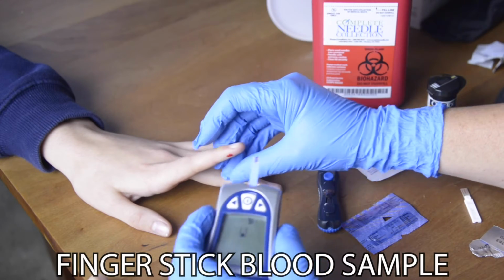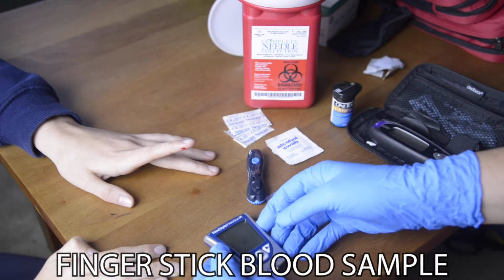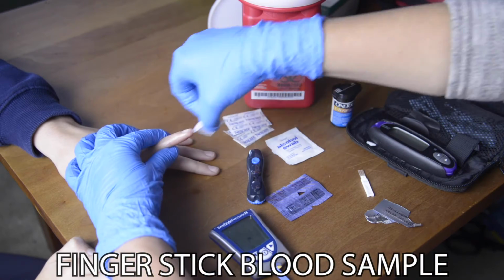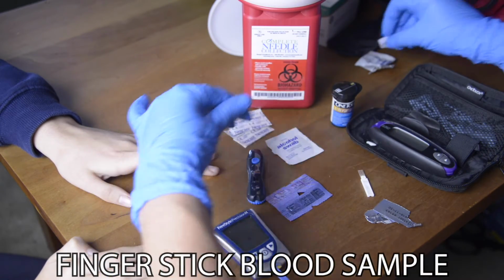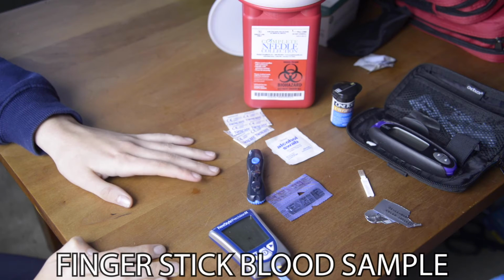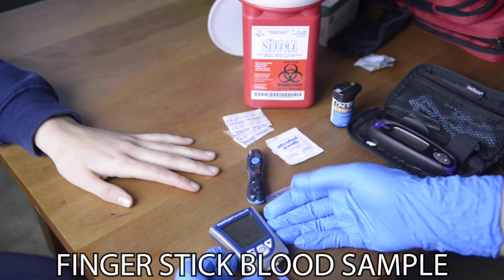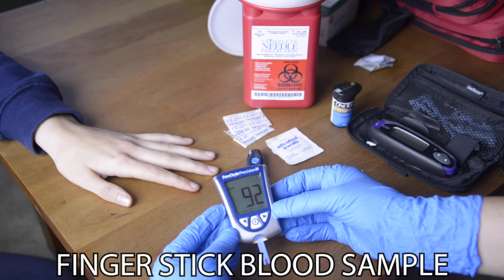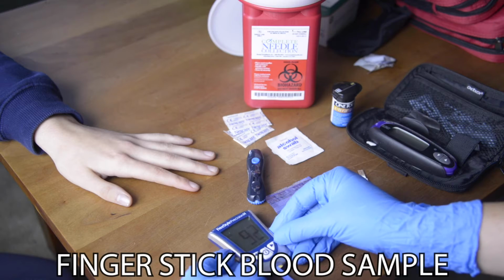So a properly calibrated meter, and we can wipe this and give them a Band-Aid if necessary to stop that bleeding. So they have a blood glucose of 92.